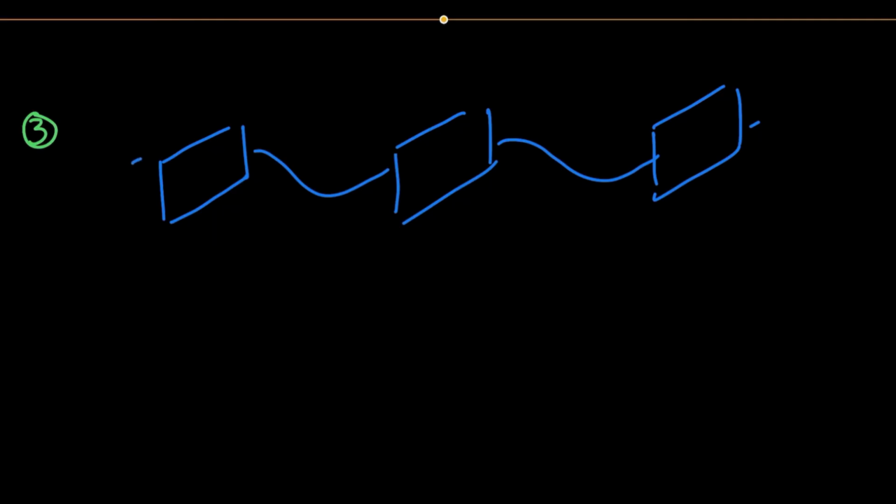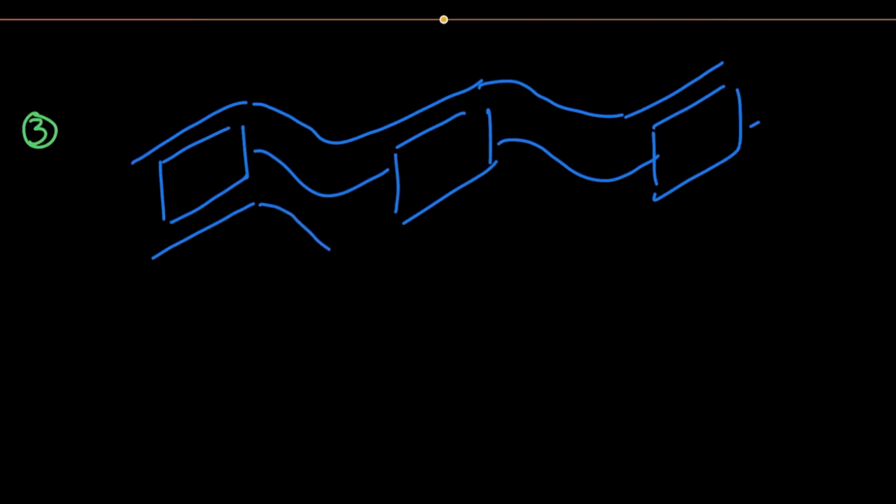You'll see the walls of the LVOT going into aorta. Actually, this will be the walls of the aorta on either side.